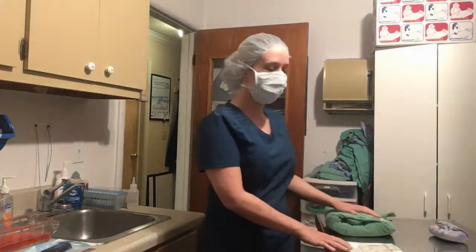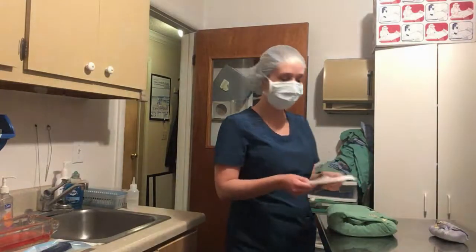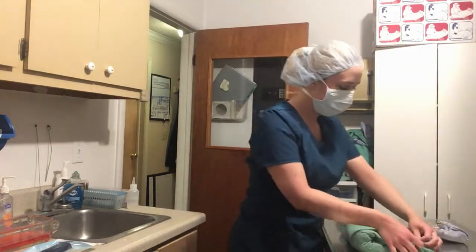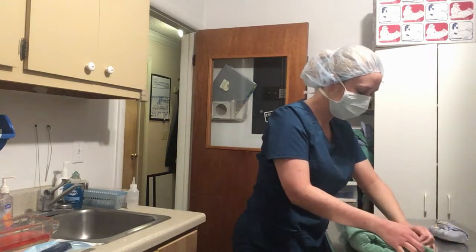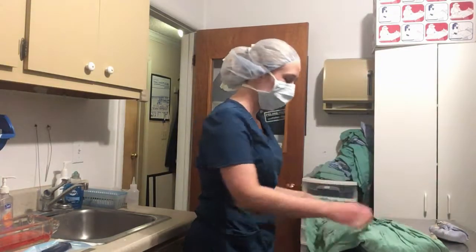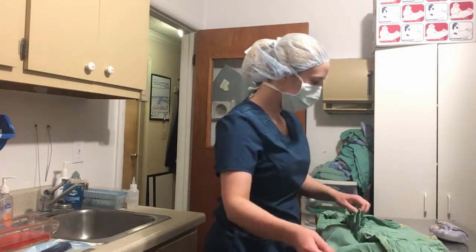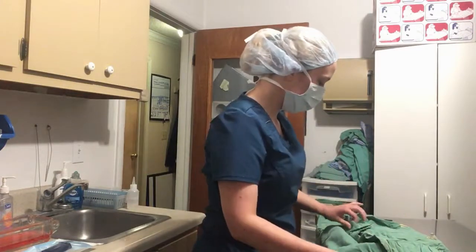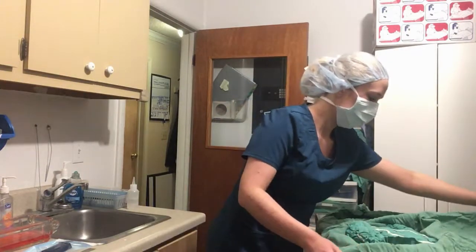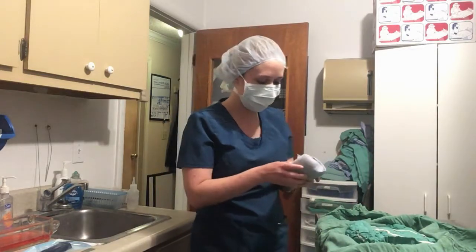So I'm going to go ahead and set up my gown, my sterile towel, and my gloves. I'm going to go ahead and open all of this. Now I have my sterile field that is available for use.